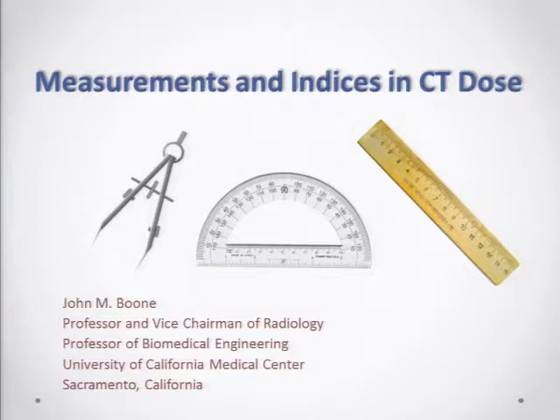So indeed, I think these are the recommendations of the ICRU report, and I'm sure this will also be discussed in AAPM circles, that when you get a new scanner for acceptance testing, you use a phantom, but you also characterize the tube output. I didn't talk about this, but we can talk offline. With that real-time probe, you can measure the output of the tube very nicely, both in the fan geometry, and I wrote two papers on that, as well as by translating that probe through the beam and measuring what Dixon calls F of Z, and you're really characterizing the X-ray beam. When you go back for acceptance testing, as long as those two measurements in air are the same, we're suggesting that you don't need to use the phantom. The dose in the phantom will only change if the dose output characteristics of the tube head change.